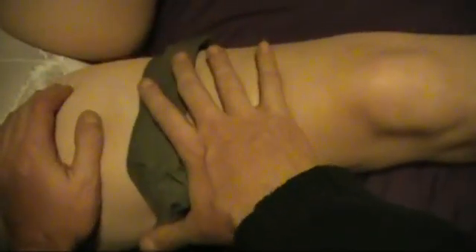Plain and simple. Now, you might be immediately tempted to take and put your windlass right here in the middle of the knot. Don't do that. That's actually kind of important because this will secure your windlass once you're done. Now, for your windlass, you can use anything. Hunk of metal, okay? 50 cal round. Stick, whatever. Remember, whatever you're going to use has to be strong enough for you to twist it around. Think, look around. Anything that's a metal bar or a bar of something you can stick in there. Your environment will give you clues as to what you can use.